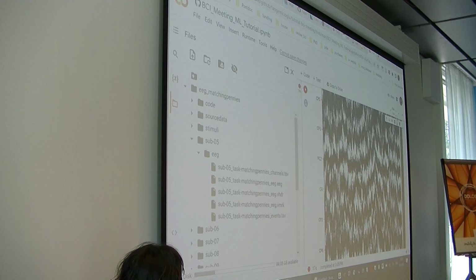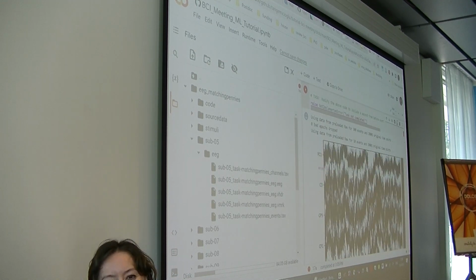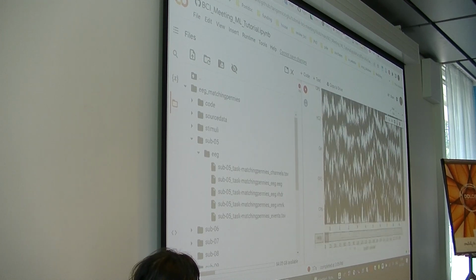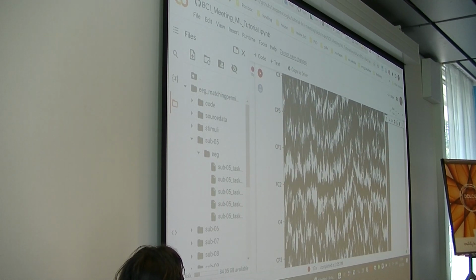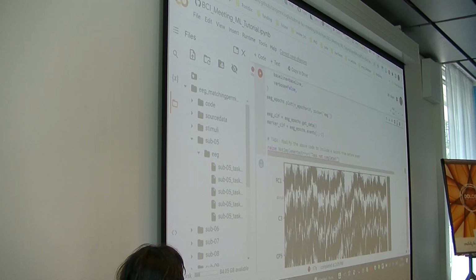So, besides the glitching, we now have the data separated into different epochs, and you might already be seeing some repeating patterns here in these 4-second time chunks. Maybe if you close the left window. Nice, good. Thanks for the fix.